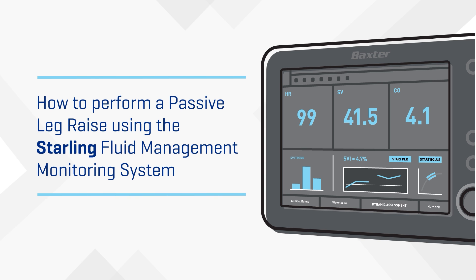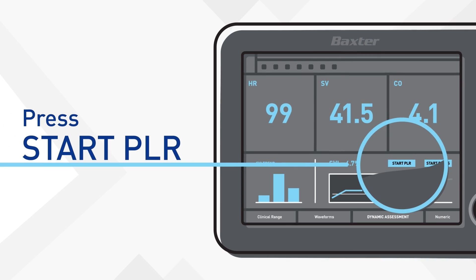Will fluid be effective for your patient? Find out in just two easy steps. Press Start PLR and let's jump right in.